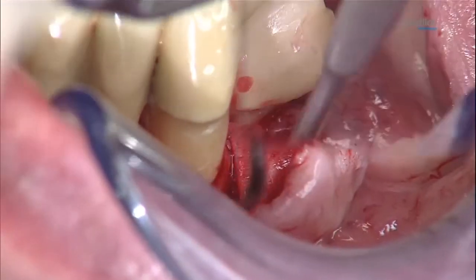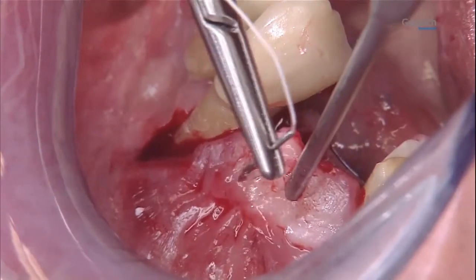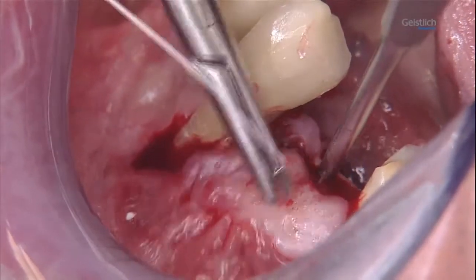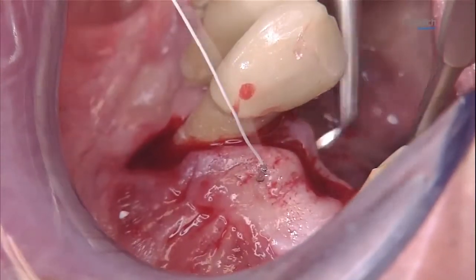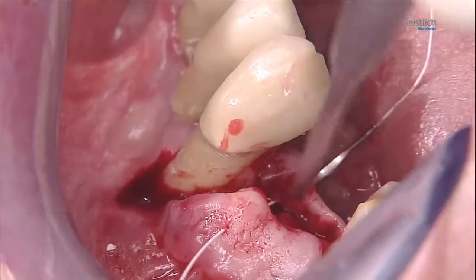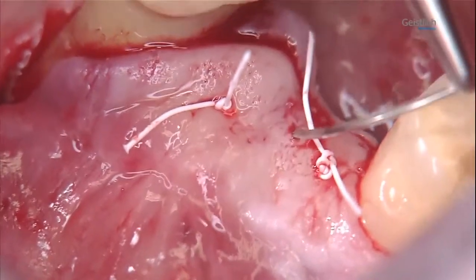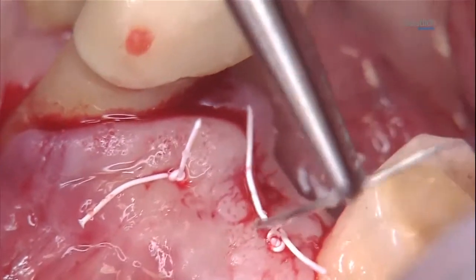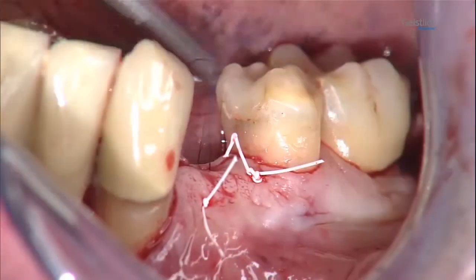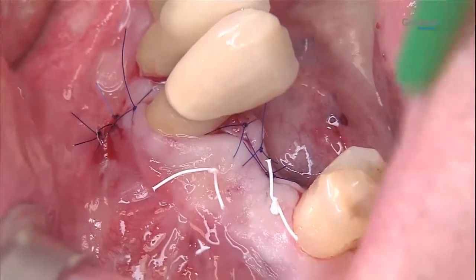The Geistlich BioGuide membrane is then laid over the Geistlich Bio-Oss Collagen. It covers the defect and is wetted with sterile saline. The tip of the membrane is pushed under the lingually mobilized flap. During suturing, we can clearly see the vestibular scar created during the original root resection. The surgical access is initially closed for adaptation of the flap edges with two crestal mattress sutures. For further healing, it is advantageous if the surgical area is tightly sealed with additional interrupted sutures.